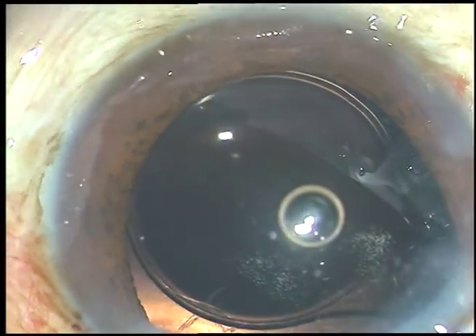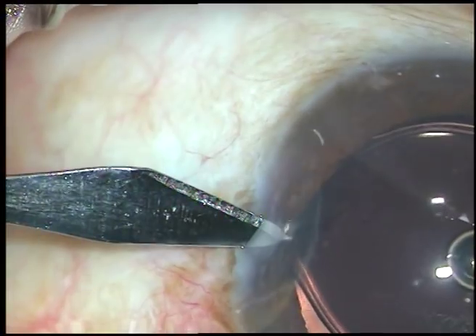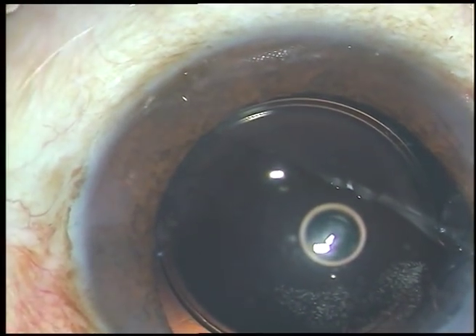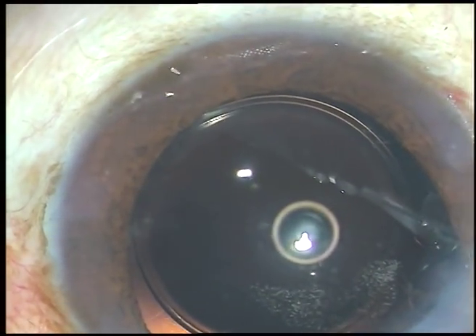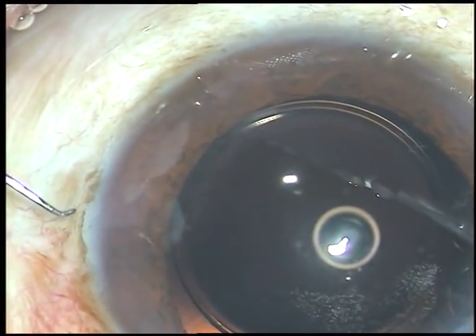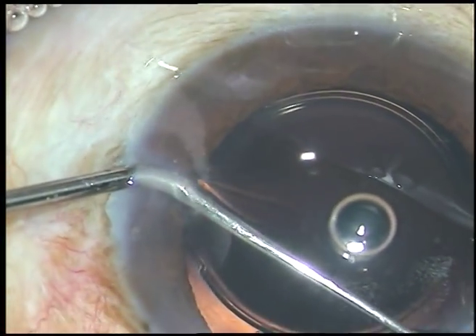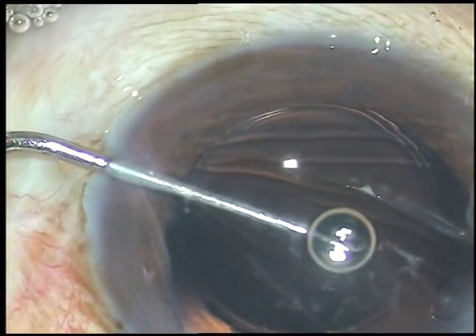The main incision is at around 10:30 or 11 o'clock. Now I want to make another side port. Through this side port, I am introducing a Sinskey hook, and I want to pull the vitreous strands towards the center. I am hooking them and pulling towards the center.